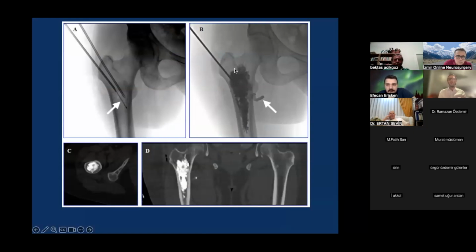Another lesion involving the proximal aspect of the right femur, so you can see the positioning of the needle, and afterwards through the needle we position the RF probe. We pull a little bit back the needle, and afterward we will perform the RF ablation, and afterwards the cementoplasty to have consolidation, and here you can see a small venous leakage.